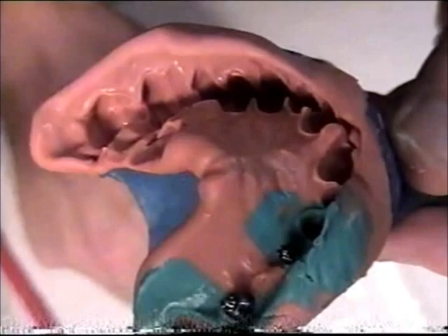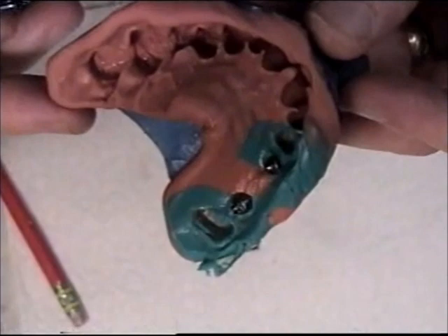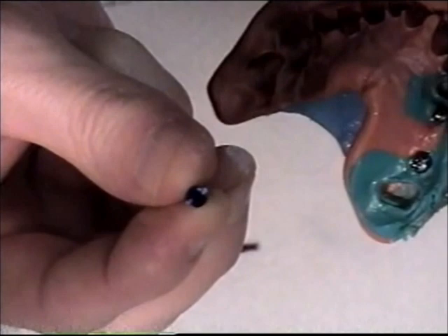Now in the laboratory we have to duplicate what's in the mouth, and so we use analogs to duplicate the implant. So I'm going to place the analogs onto the pickup copings and screw them into place. Then I will pour my soft tissue material around each one. Okay, I have my analogs now. Now the analogs are an exact duplicate, a replica of the implant.